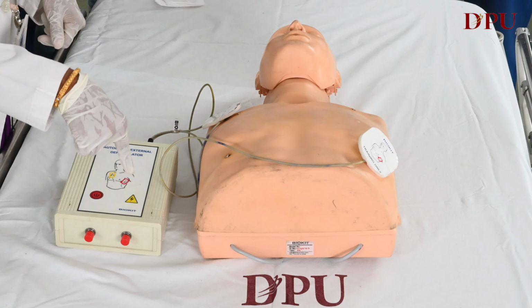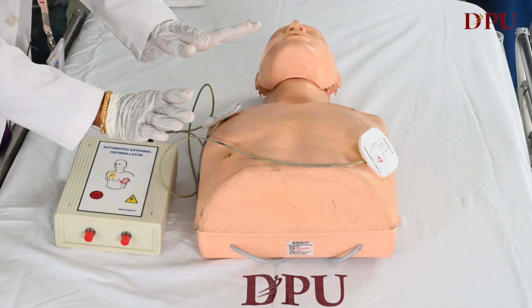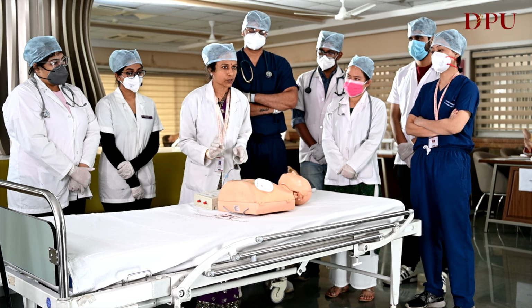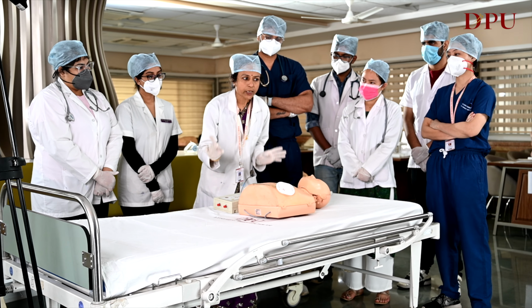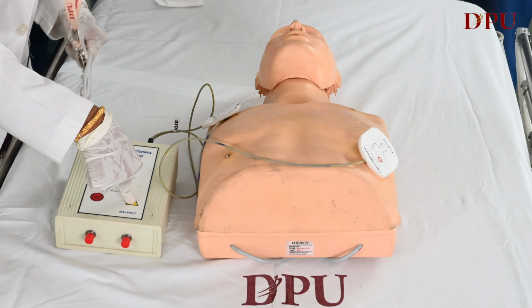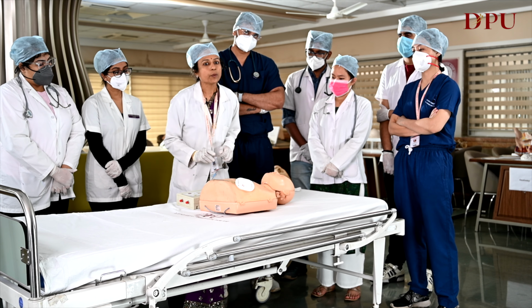But whoever is pressing the shock button, you have to make sure that he is not touching the victim, and nobody else is touching. So he has to say, I am clear. Is everybody clear? After making a visual check that nobody is touching the victim, you press the shock button. It will get charged and the shock will be delivered.